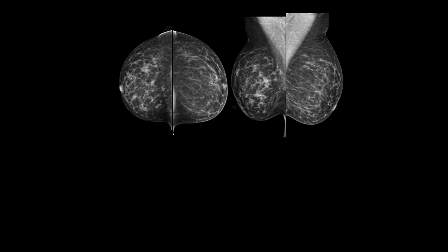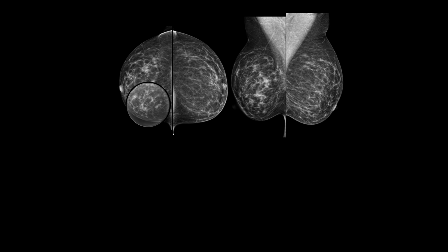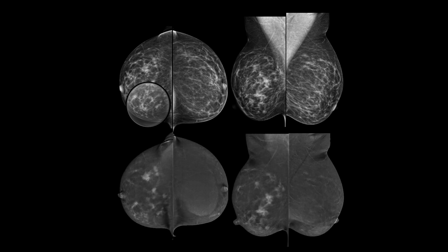This is a good example because this patient doesn't even have a dense breast. And of course, we can appreciate that there are a few asymmetries on the scattered fibroglandular densities, and she was called back for that. Look what we discovered. And again, in one appointment, we appreciate that there is no abnormality on the left breast.